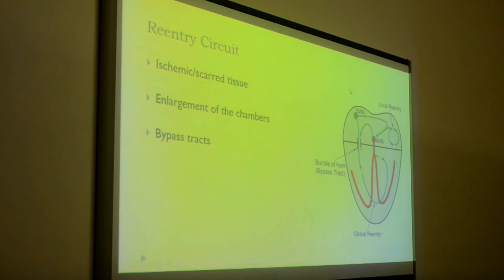So, doctor, yes. Atrial fibrillation, many circuits? You have many firing at the same time. Yes. Here you could have, for example, an atrial reentry circuit. Here you have a ventricular reentry circuit.